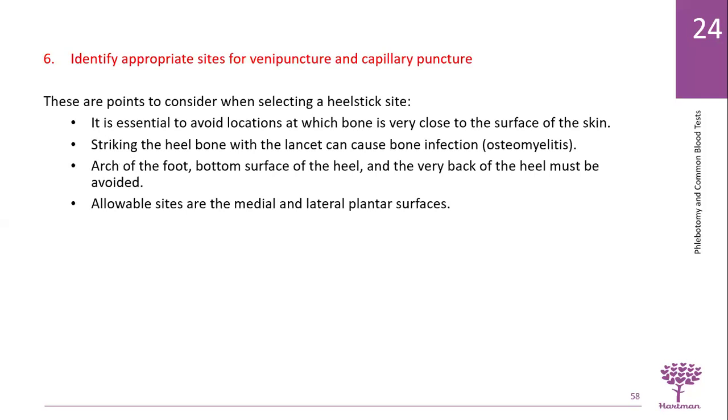Points to consider when selecting a heel stick site. It's essential to avoid locations at which bone is very close to the surface of the skin. Striking the heel bone with the lancet can cause bone infections such as osteomyelitis. You need to know this.